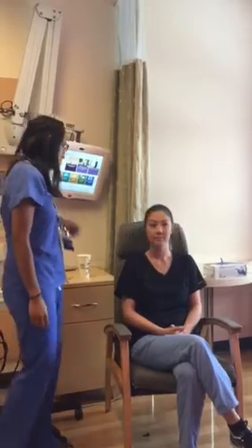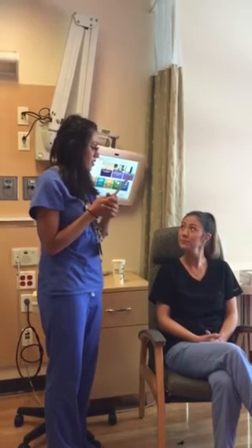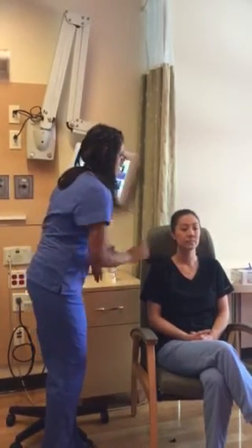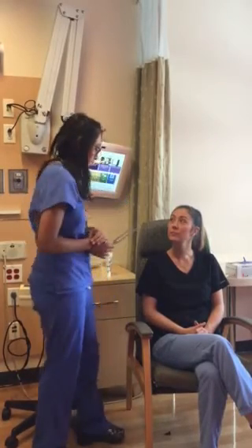So next I'm going to do the Weber and the Rinne tests. So Tiffany, I'm going to hit this tuning fork, and I want you to tell me if you can hear it better in one ear or the other, or in the same both ears. Okay? Same. Okay. And so I would then check the other ear like I did with my otoscope, so just make sure you do that as well.